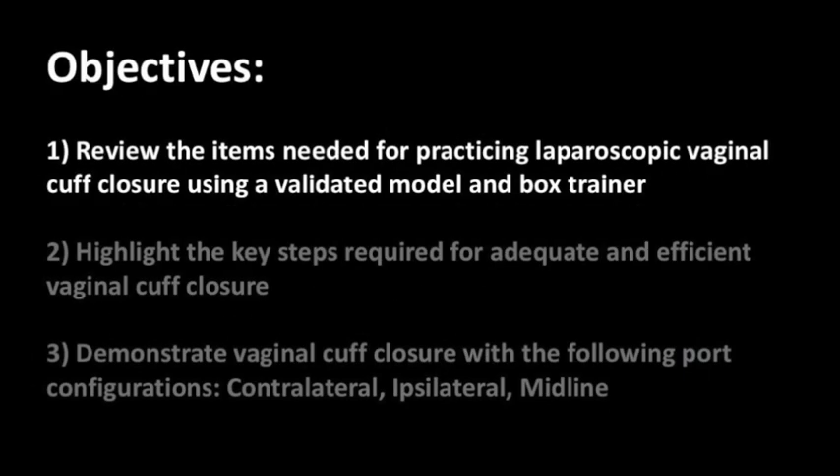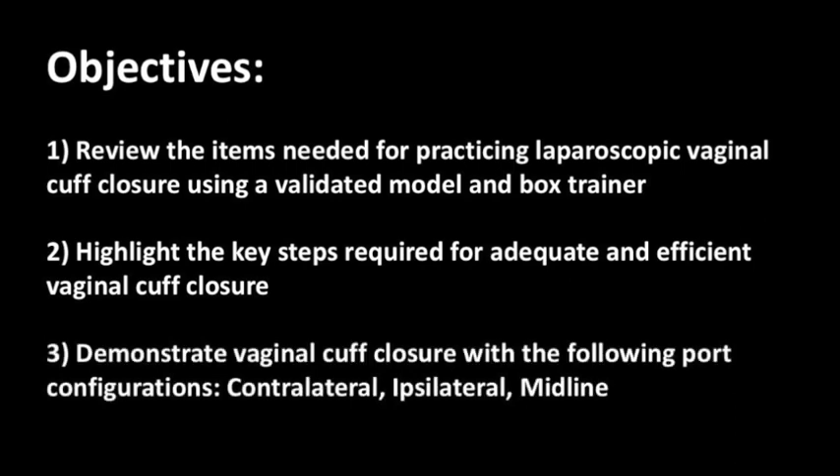The objectives of this video are to review the items needed for practicing laparoscopic vaginal cuff closure using a validated model and box trainer, to highlight the key steps required for adequate and efficient performance of this task, and to demonstrate vaginal cuff closure with three different port configurations.